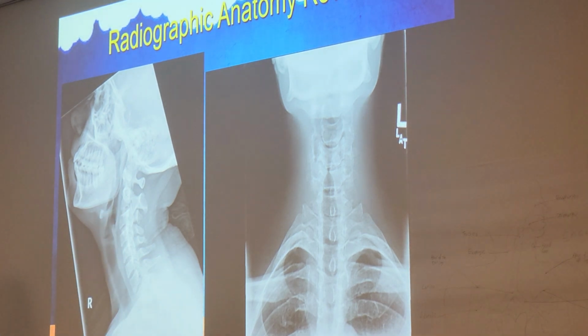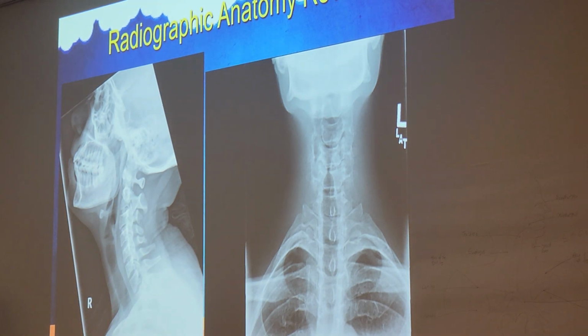It's hard to tell. It looks like they turned their tube. I don't think it's an issue with the breathing. If I was to guess, they turned their tube. Why you would do that on a soft tissue neck, I don't know. I guess they're just trying to be creative or something.